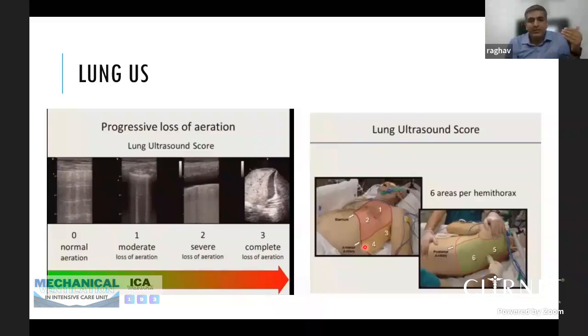The fourth method is lung ultrasound, which is commonly done at the bedside by the intensivist who is looking after an ARDS patient. The lungs of an ARDS patient can be scored, as shown in this figure, from 0 to 3. The 0 is normal aeration pattern. We see A lines throughout. The score 1 and 2 is some loss of aeration. We will see B lines in score 1 and 2. And score 3 means complete loss of aeration. We will see C pattern or consolidation.